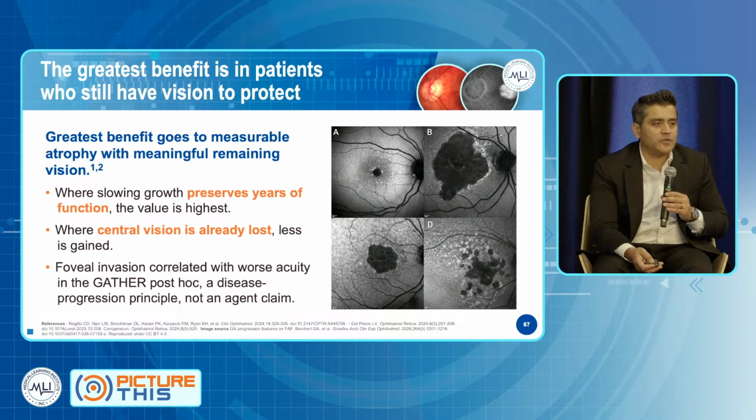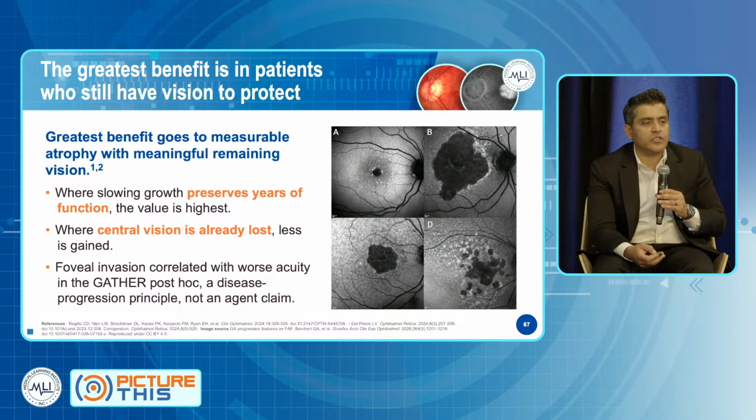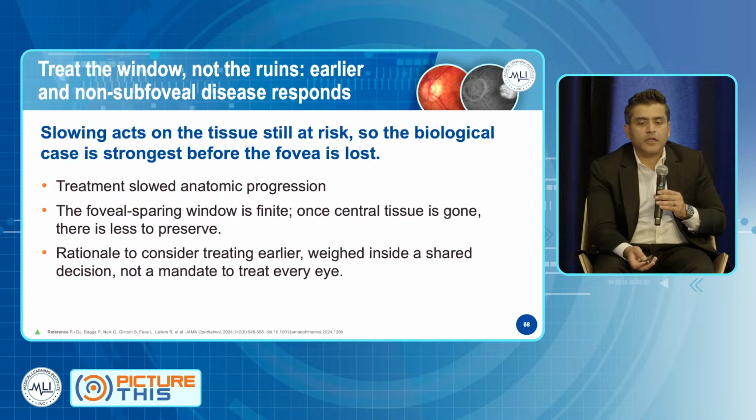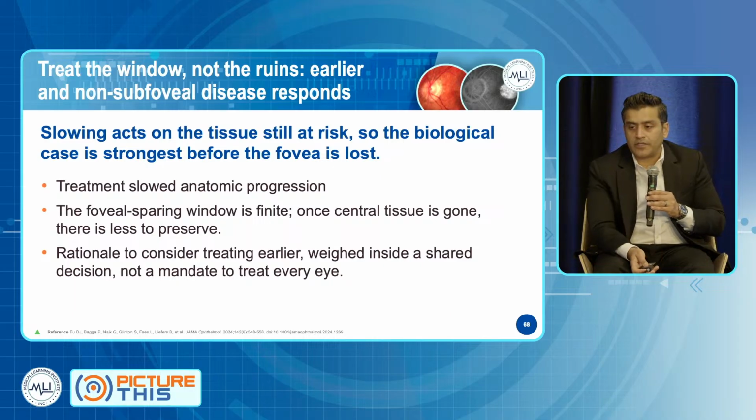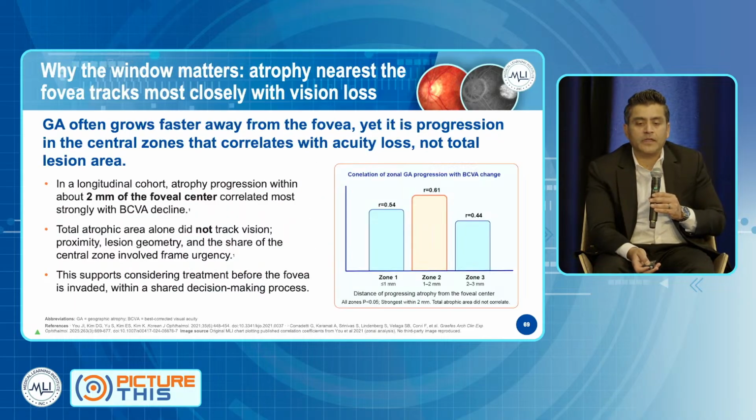But if the whole house is on fire, it's too late. And so I think as a field, we are moving towards early intervention before involvement of the fovea. And I think starting non-foveal, non-subfoveal, or even further away lesions with high-risk characteristics that Glenn talked about is the key to actually help our patients.